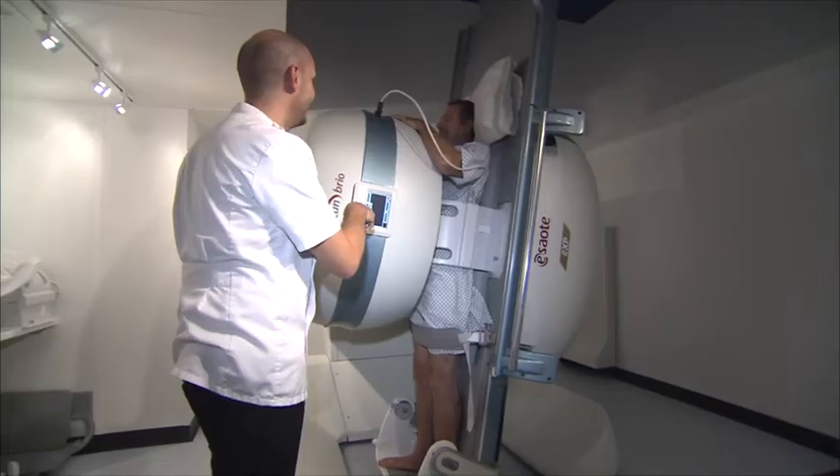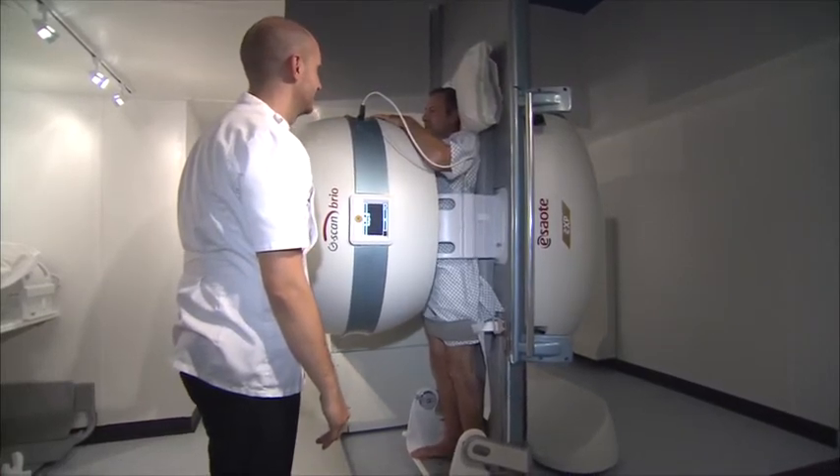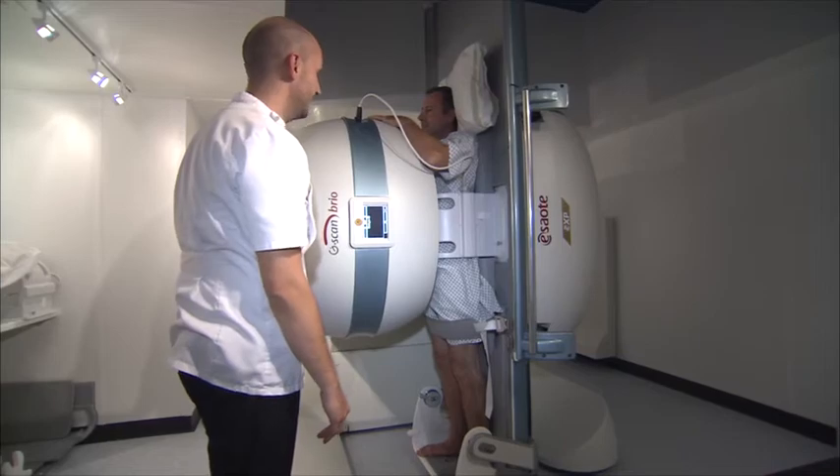It has shown entrapment of nerves, which clearly has been the patient's problem. So this means that the orthopaedic surgeon or whoever is looking after that patient knows what the problem is and can therefore find a definitive treatment.